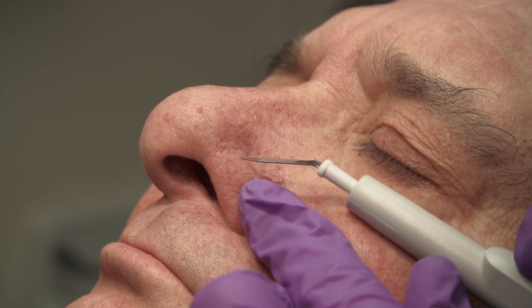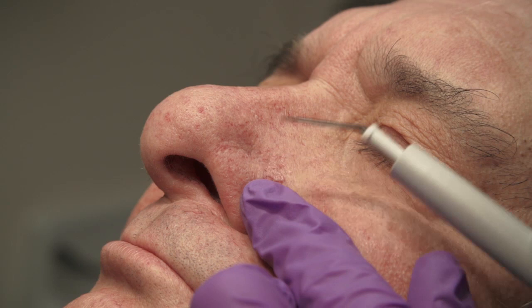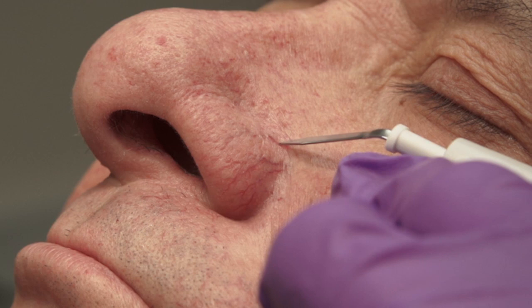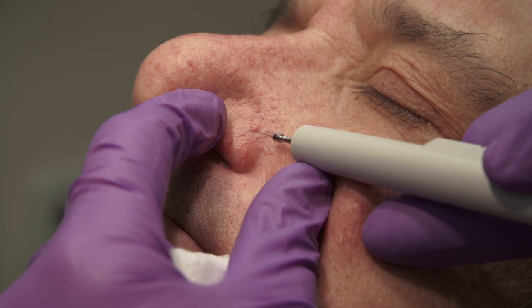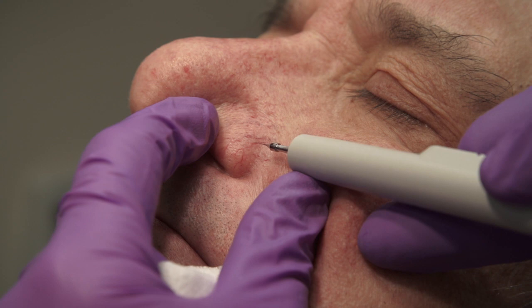Facial telangiectasias can be treated with electrosurgery using the disposable sharp-tip electrode with a power setting of 2.0 watts on low. The electrode is touched gently to a portion of the telangiectasia, and the button on the handpiece is carefully pressed. Treatment may also be performed using a sharp epilation needle with a similar power setting. The handpiece should be stabilized so that it does not move when the button is pressed.